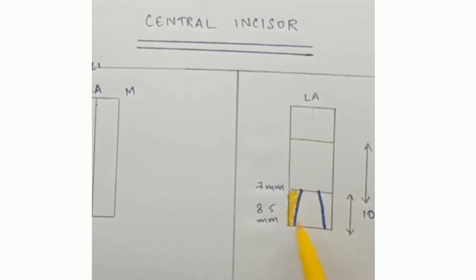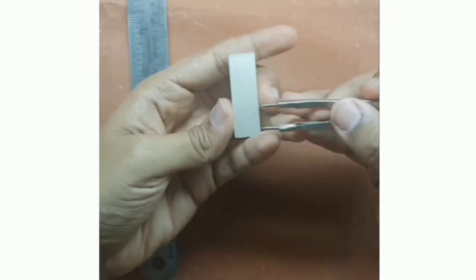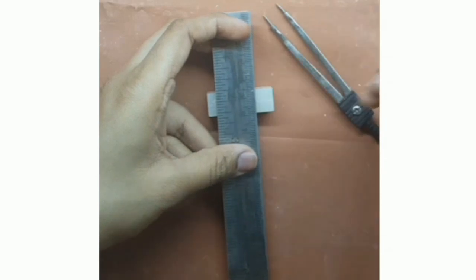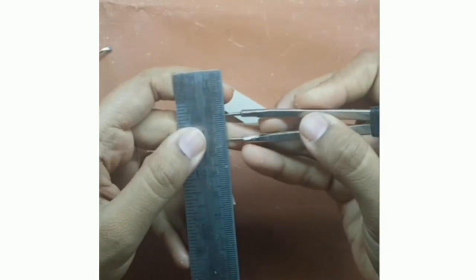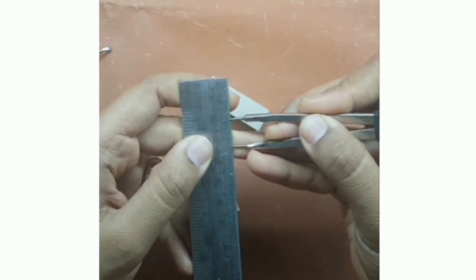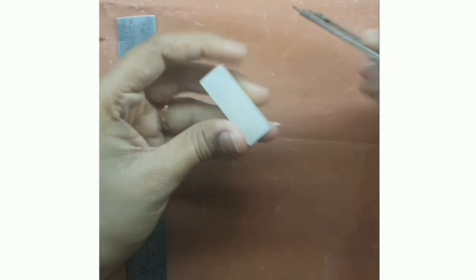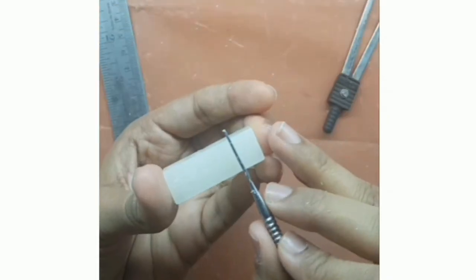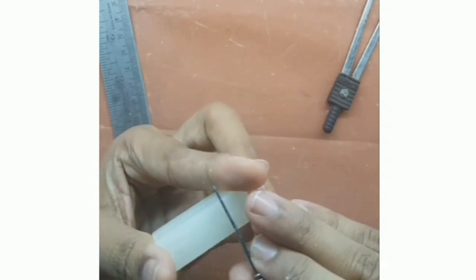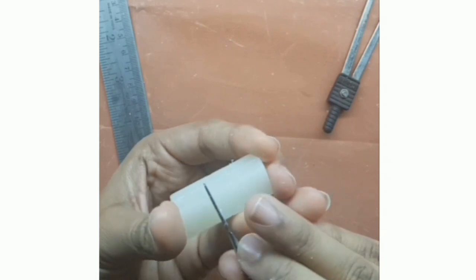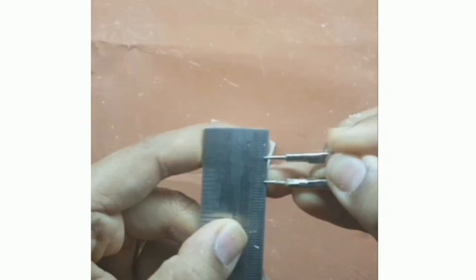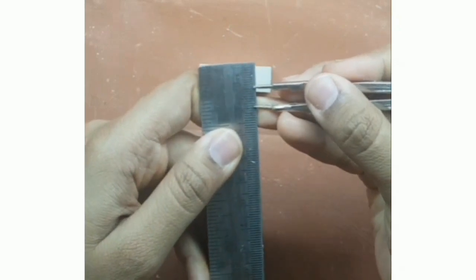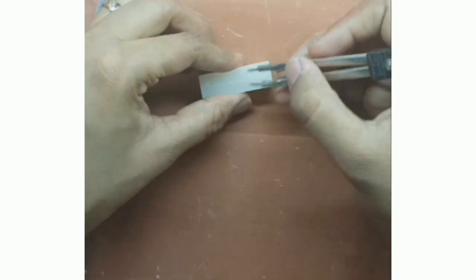Now remove the excess wax from both the sides. With the help of a divider, measure 10.5 mm — that is the crown length — and mark it on the labial aspect. Now measure 13 mm — that is the root length — and mark it on the labial aspect. Now extend the crown and the root length on all the four aspects. Measure 8.5 mm and mark on the middle third of the crown, and measure 7 mm and mark at the cervix.